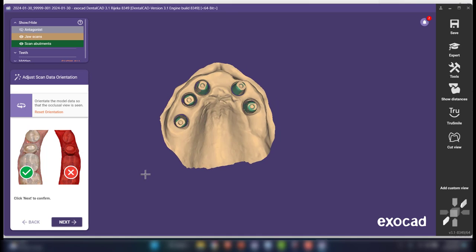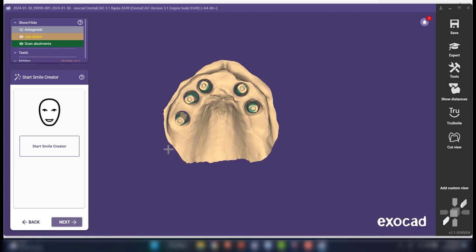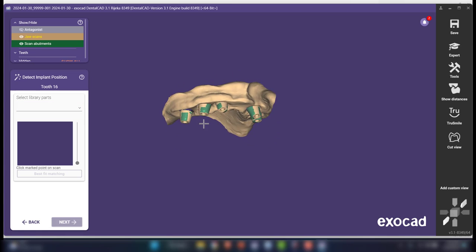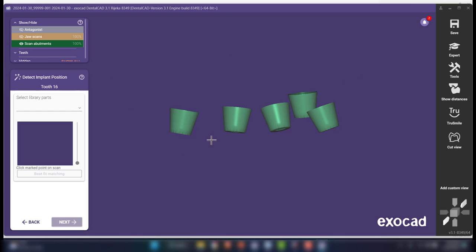So it wants us to set the orientation. We're just looking at the occlusal. Click next. I don't want to do the smile creator right now. And so now we would indicate our scan bodies. All right. So remember, the scan bodies that we're actually going to be clicking on are the green ones. Those are the corrected ones.